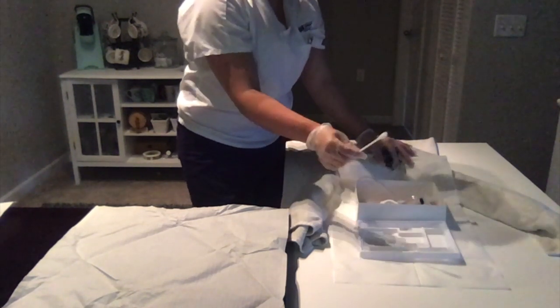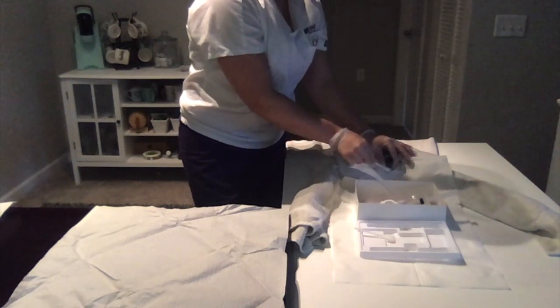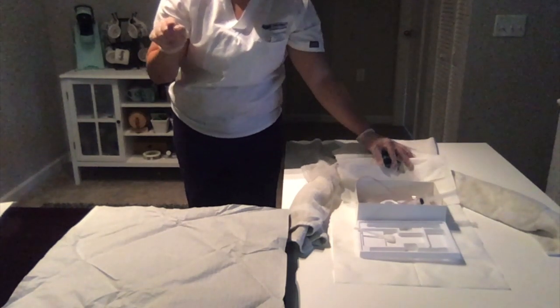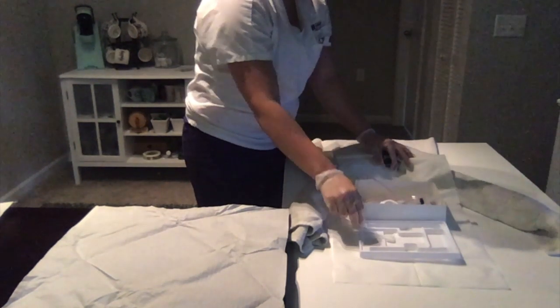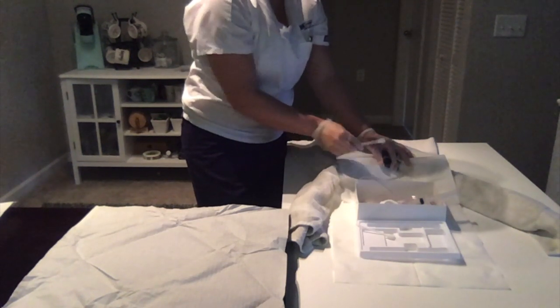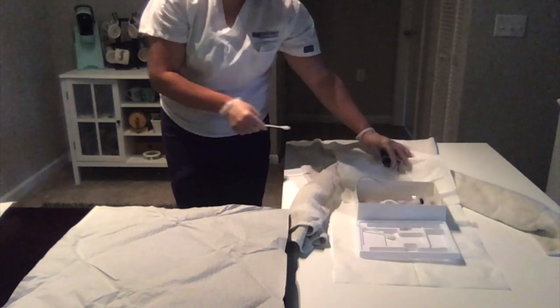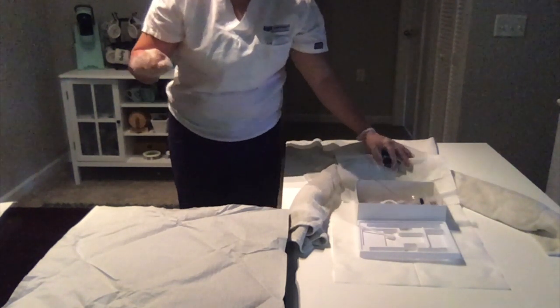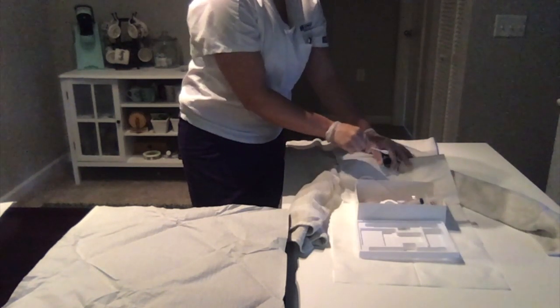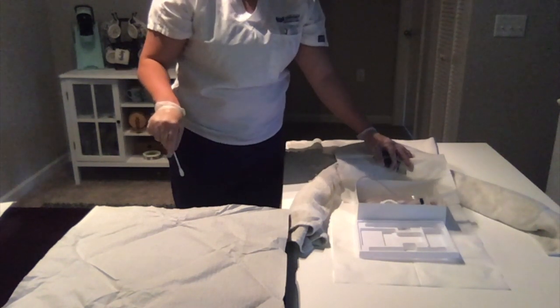So I'm going to take my cotton swab and I'm going to go around and downward, and then I'm going to go around my sterile field and drop it in the waste bucket that's below me. And then with this Q-tip, I'm going to go to the other side, around and down. Then I'm going to go around my sterile field and drop it. And then with this Q-tip, I'm going to go front to back down the center, and then around and drop it.